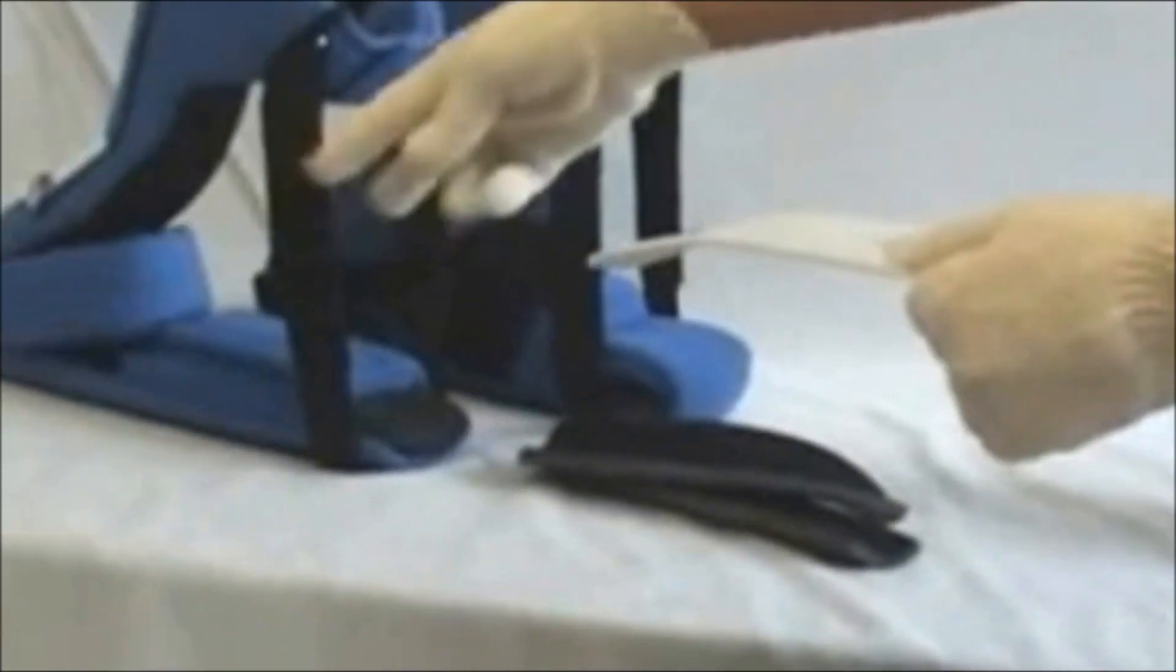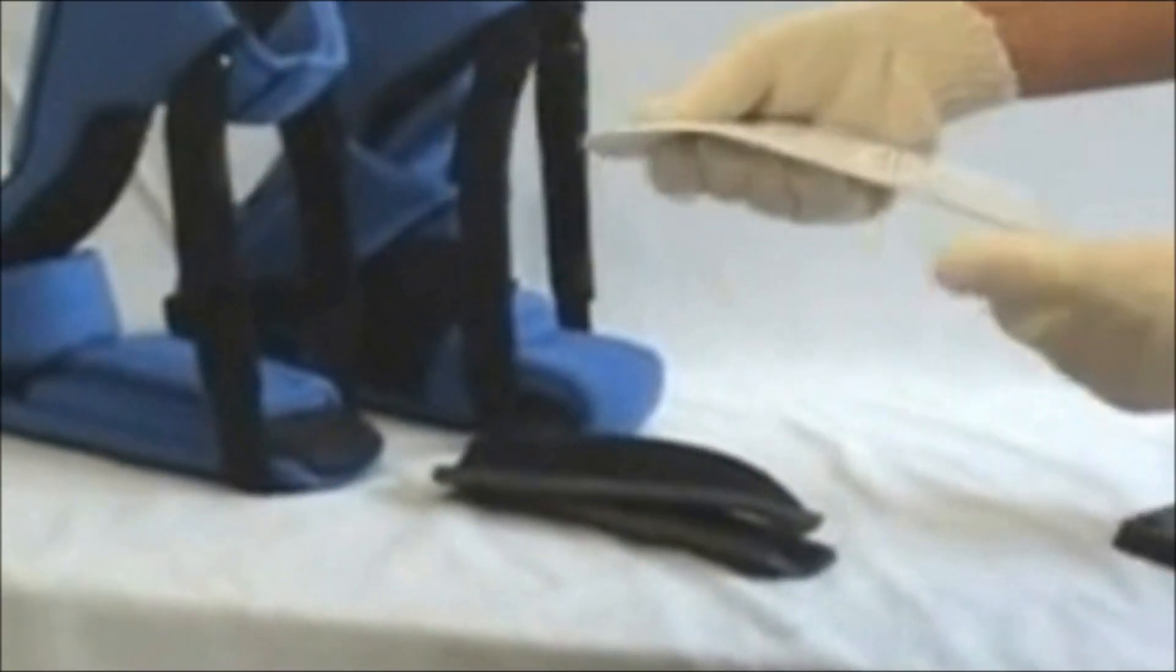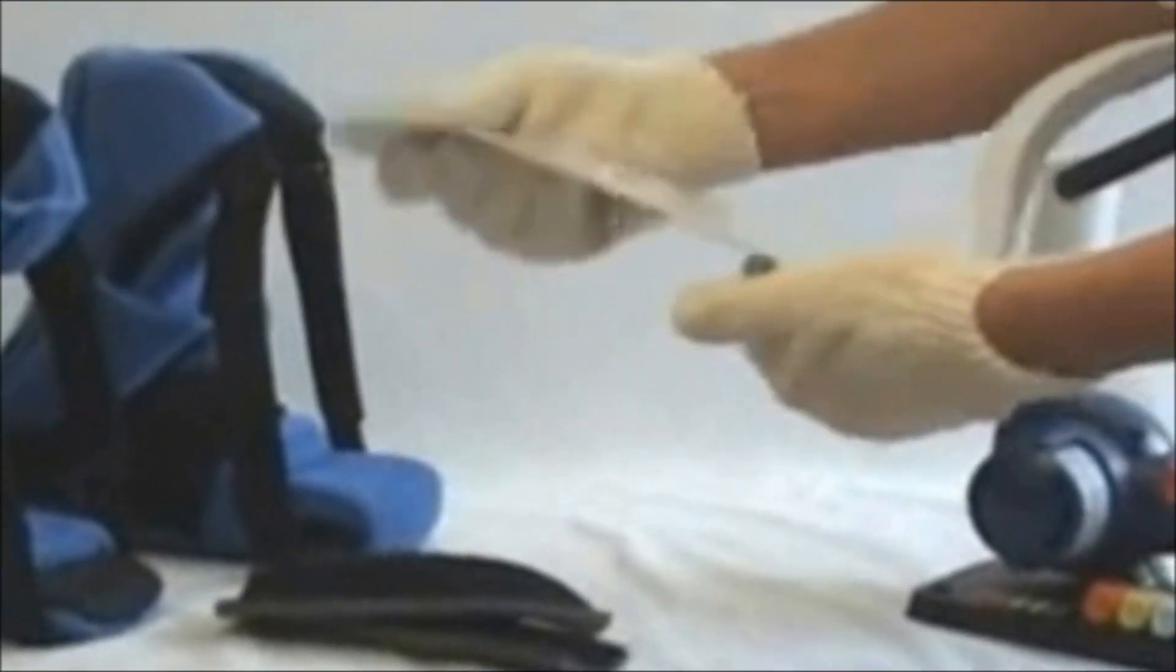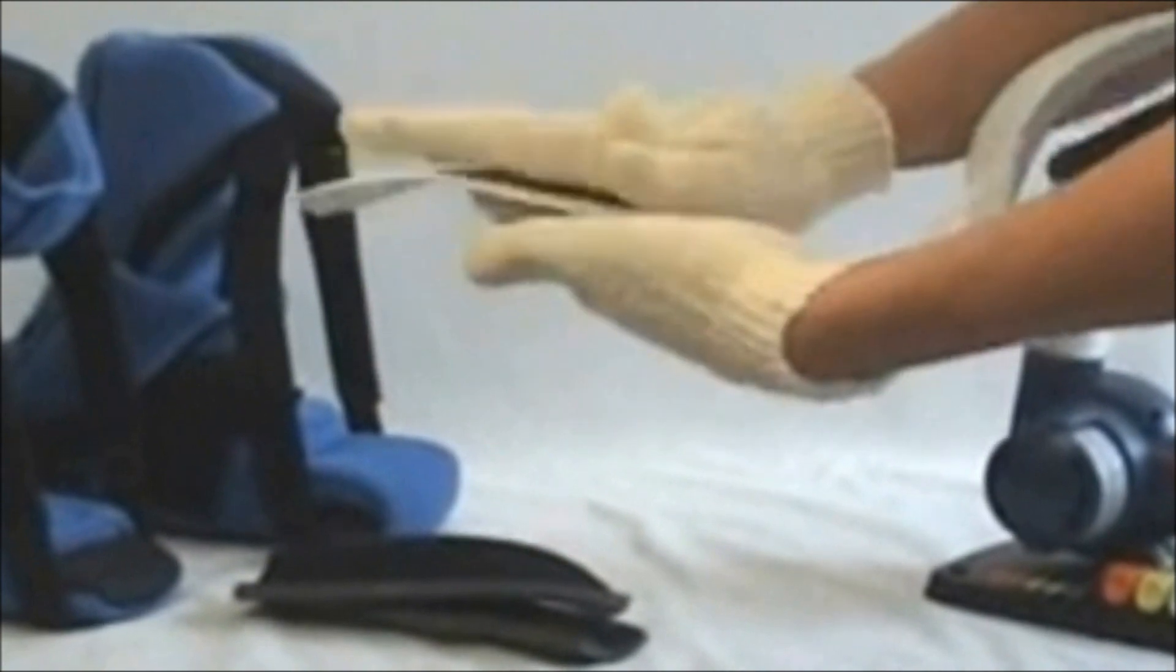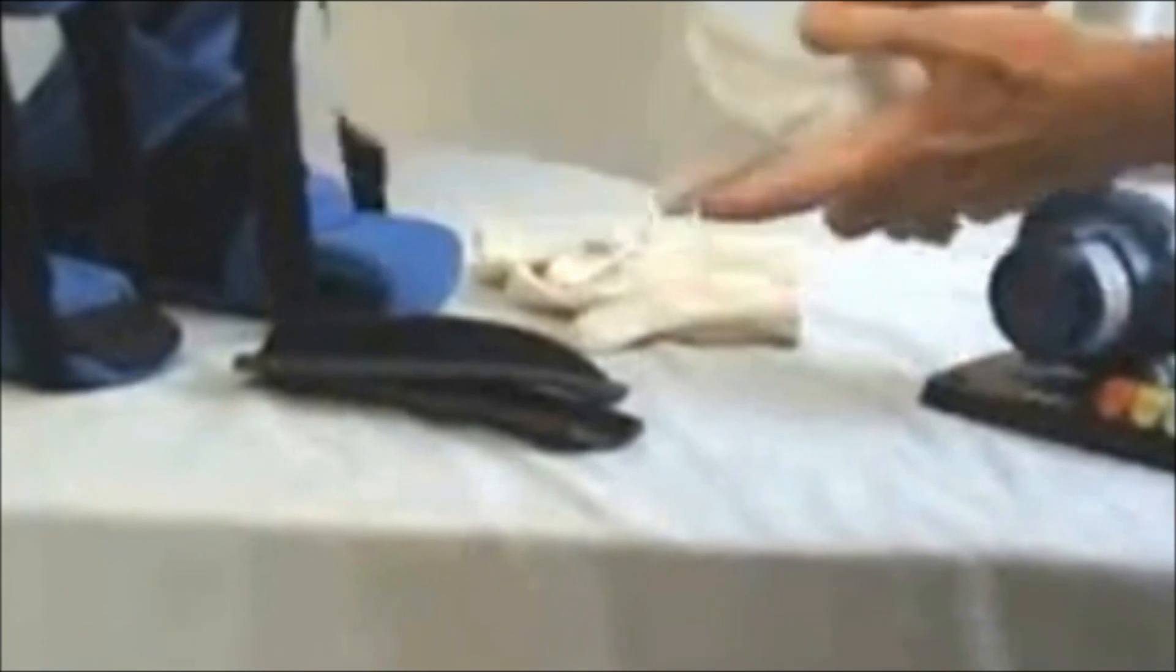The flex straps will do a very good job of bringing the patient's foot up and allowing them to push through with tone. But it's vital that you make the bottom of the boot fit the bottom of the patient's foot.